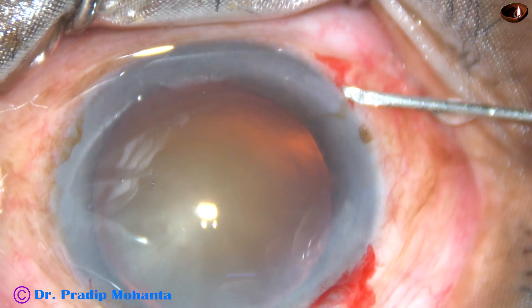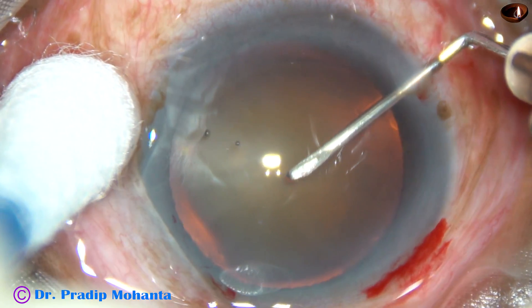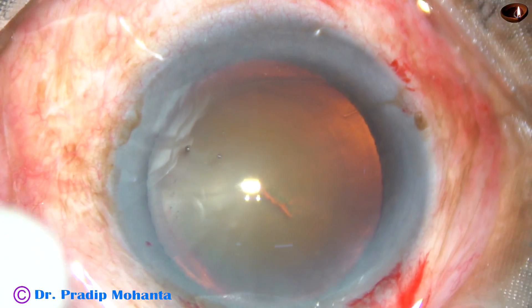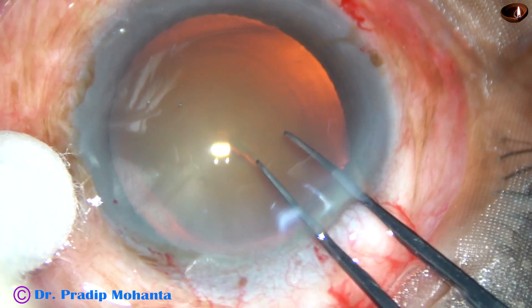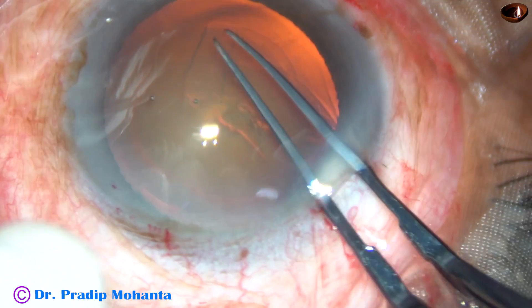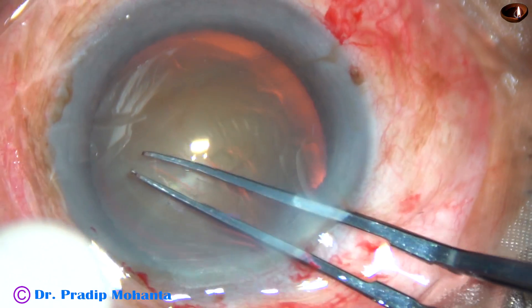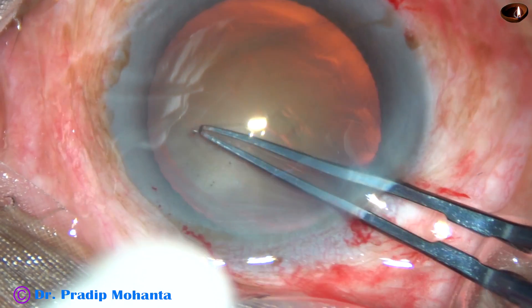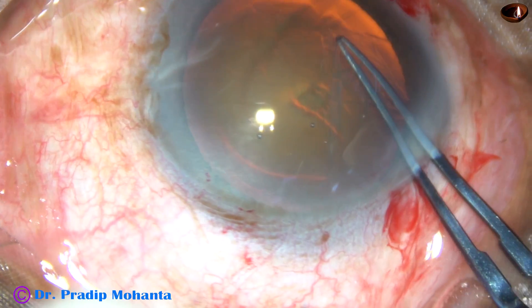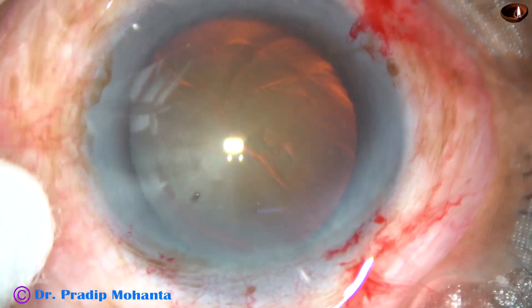And now capsulorhexis. The anterior capsule is incised with a 26-gauge bent needle. A flap is raised. I hold this flap with utrata forceps. Go anticlockwise. Remain at a certain equal distance all around from the margin of the pupil when the pupil is round, and get a round rhexis like this.